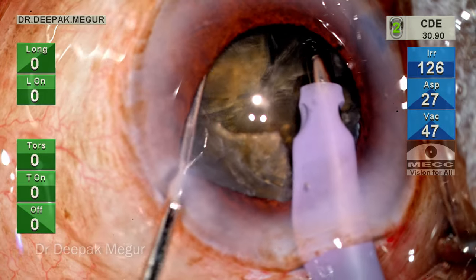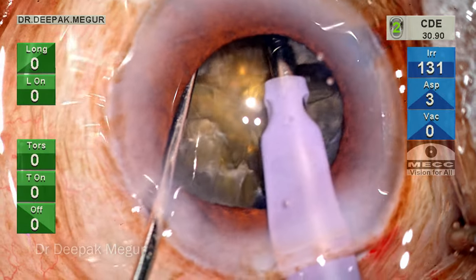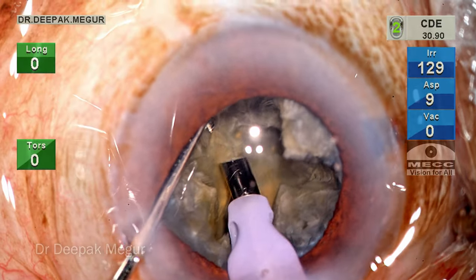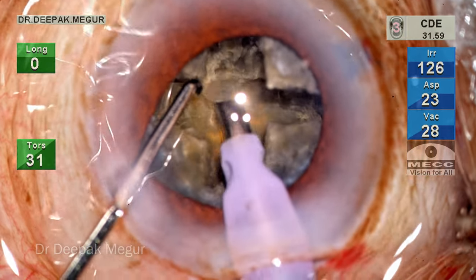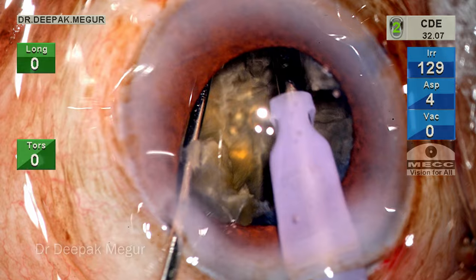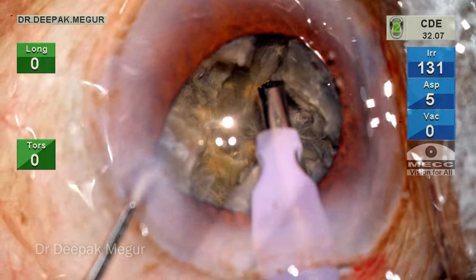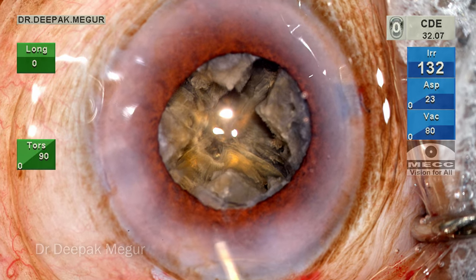At this moment, I also realize that the iris is coming out through the side port simply because the irrigation sleeve is below the pupillary level and the fluid coming out is pushing the iris and pupil out. When the third fragment is also difficult to crack, I realize my error in judgment — the posterior plate in the central part is not shaved enough. I go in and try to deepen it still. The pupil is coming down so I've asked for BSS with diluted adrenaline so that the pupil can be dilated a little.